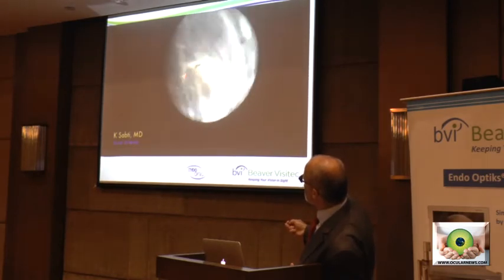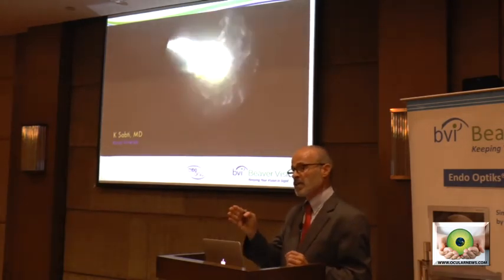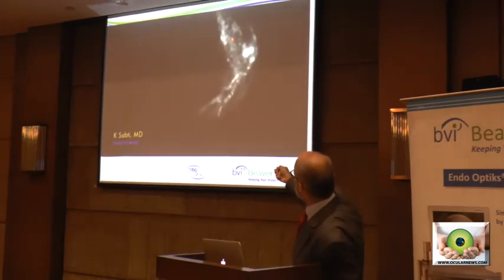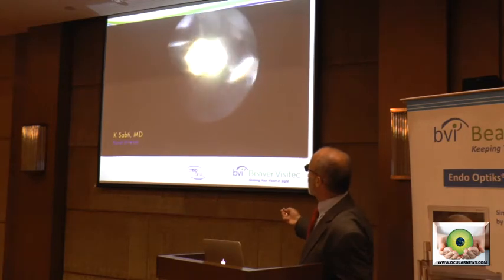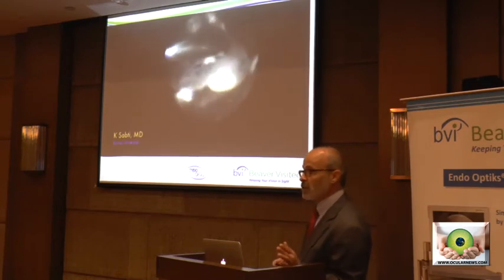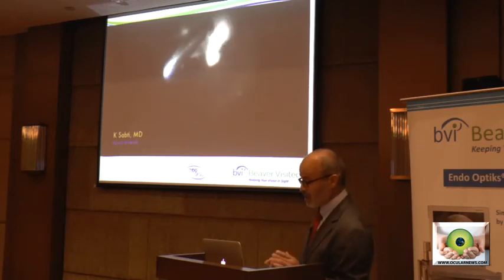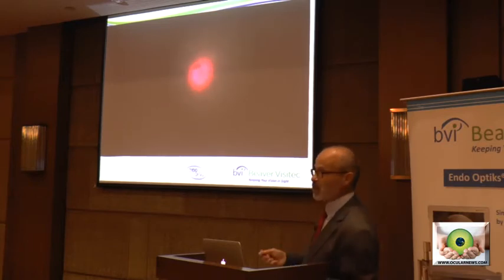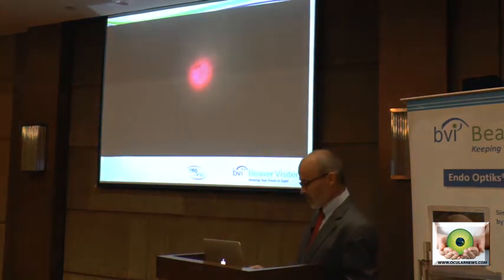The vitreous, as you start to do an endoscopic vitrectomy, looks like snow almost. Because the light and the camera are coaxial on the endoscope, things that look opaque or translucent through the operating microscope, like some of these little residual bands and membranes, very difficult to visualize through the operating microscope, are quite apparent with the coaxial illumination of the endoscope. So often people can forego staining for membranectomies because they can visualize the membrane with the endoscope alone. And now he's going on to PRP with the same instrument. So for the retina surgeons among you, it's a light pipe, an endo laser fiber, and an intraocular camera.